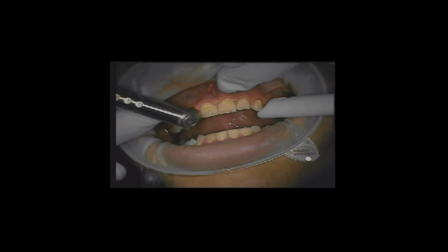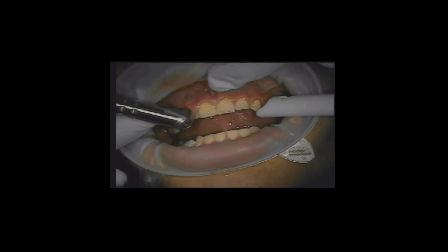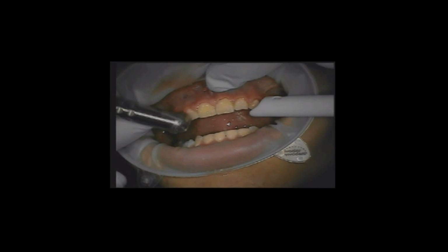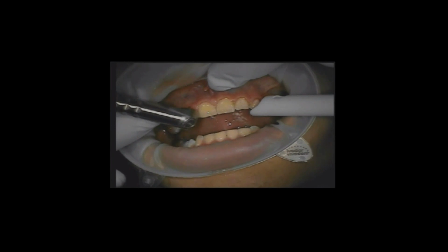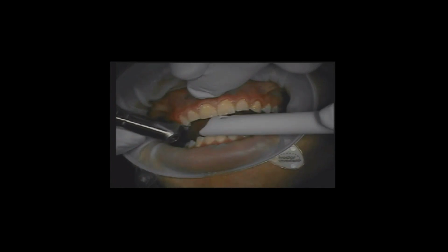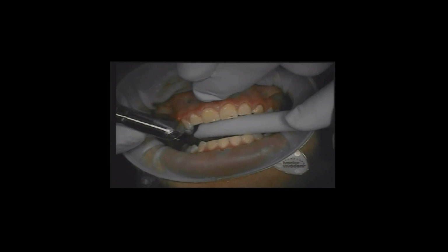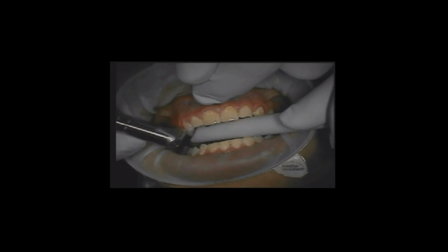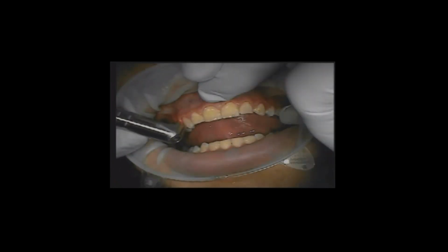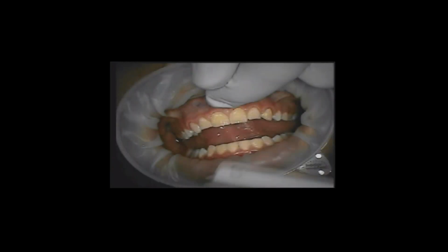I know some doctors that do this procedure with the tipless handpiece, and I've got the Lightwalker that has the red aiming beam. The newer ones with the green aiming beam, I think, give a much more precise dot. And I could see if you have a Lightwalker that has that green aiming beam, you may be able to even do this contouring totally with the tipless handpiece and not have to use a tipped handpiece at all.